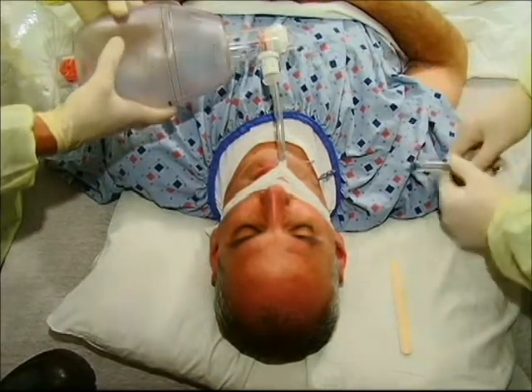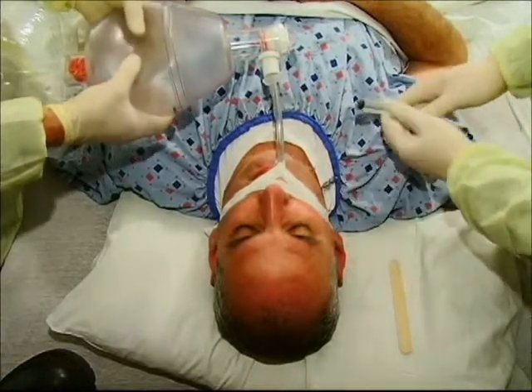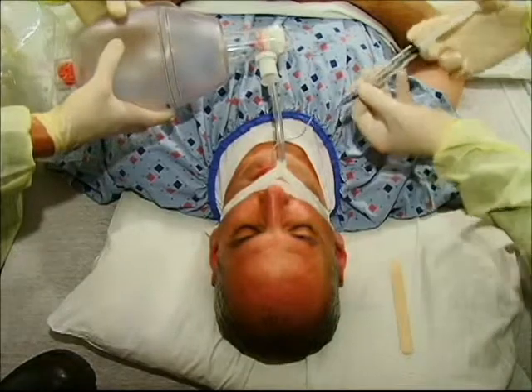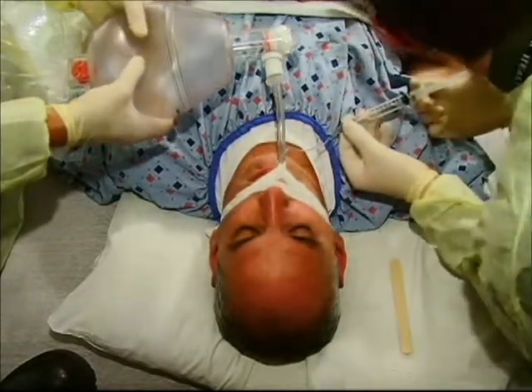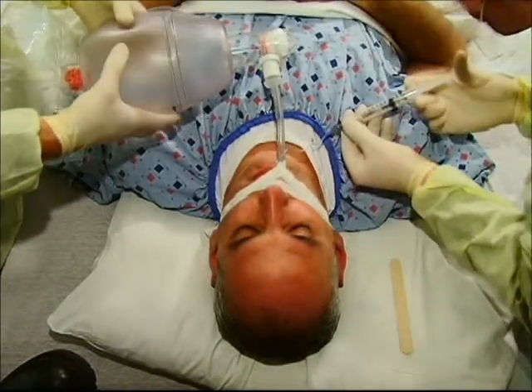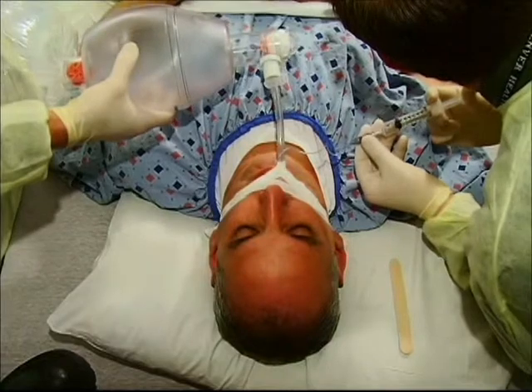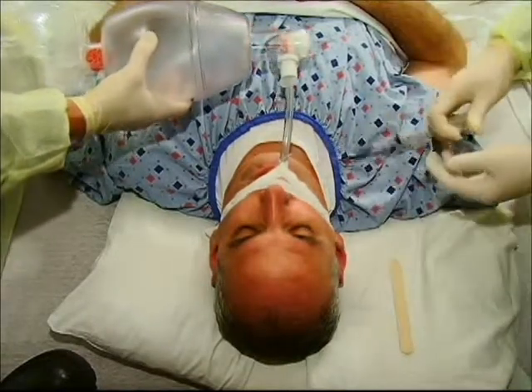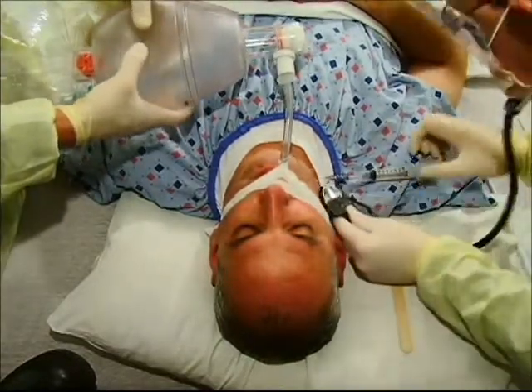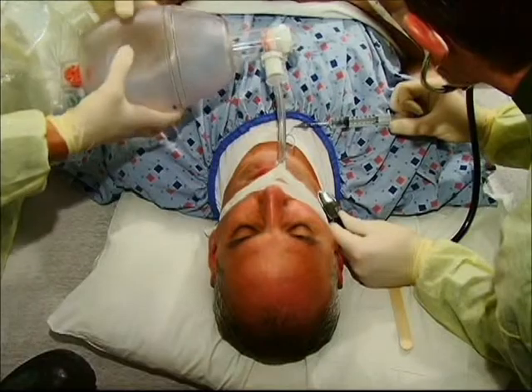Minimal leak technique. This procedure is very similar to the minimum occluding volume method and may also be practiced on an intubated mannequin. With another person providing manual ventilation, inflate the cuff slowly using a clean, dry, 10 cc syringe to inject air into the pilot balloon. Begin by injecting 1 cc of air and listen for air leaks during peak inspiration. Continue injecting air in one-half to 1 cc increments. The difference between MLT and MOV is that once you have obtained a good seal with maximal inspiration, with MLT you now withdraw a small amount of air from the cuff until, using a stethoscope, a slight leak is heard above the cuff on the lateral neck. You will know that you have created too large a leak if air is leaking through the nose or mouth.